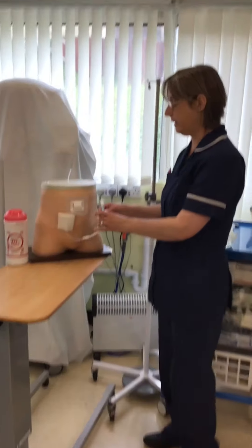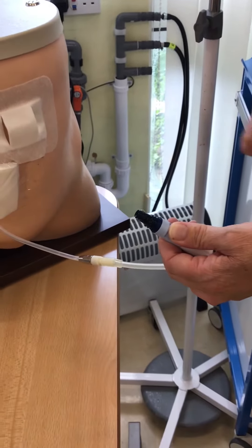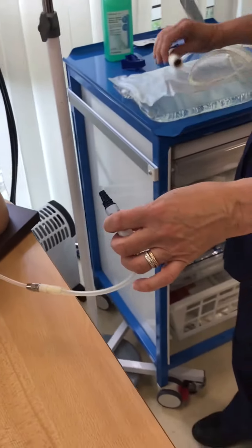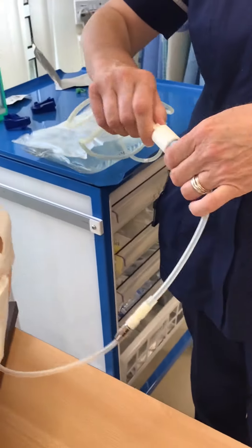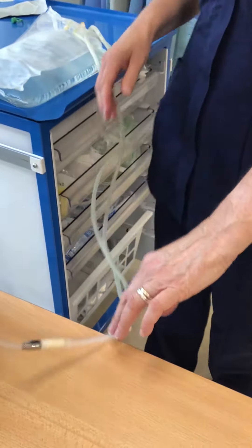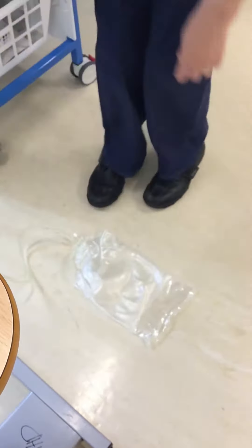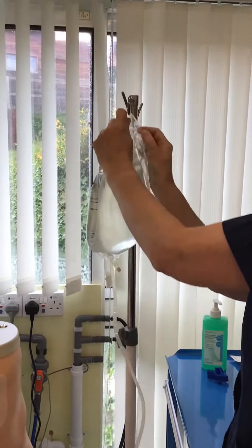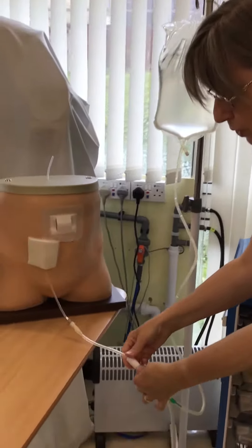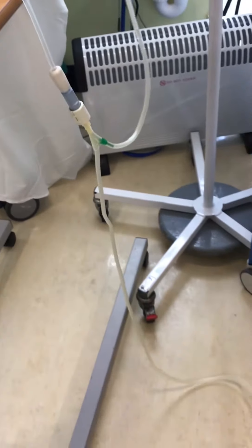Next, you need to pick up your line and carefully remove the tag, making sure you do not touch the dark blue end. You then pick up your dialysis lines and carefully connect by screwing the two together. Once connected, you split your bags, placing the drain bag on the floor with the window side up, and the full bag of fluid you hang on your hook. Then open your twist clamp to allow the fluid inside you to drain out into the bag on the floor.